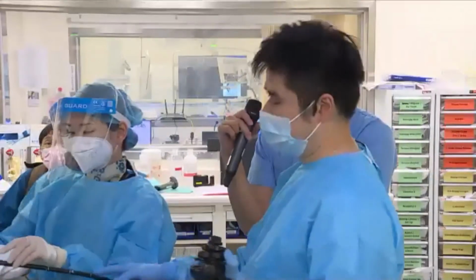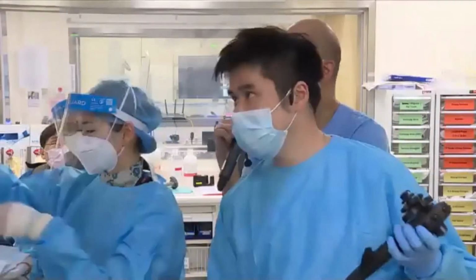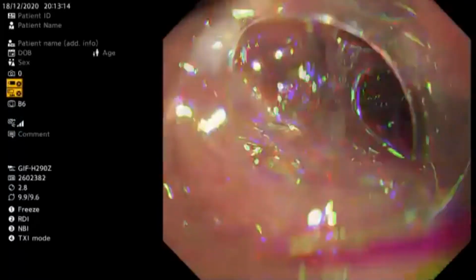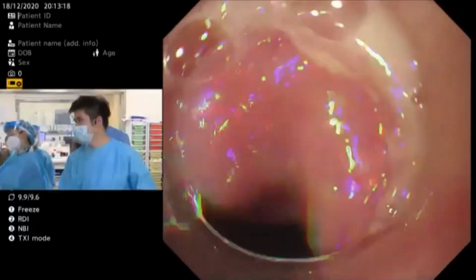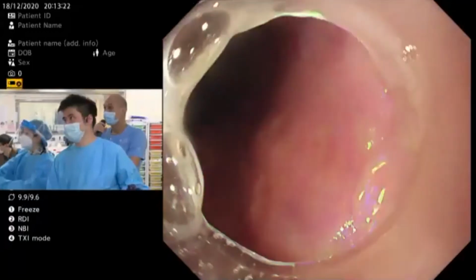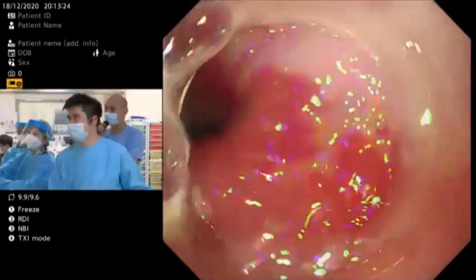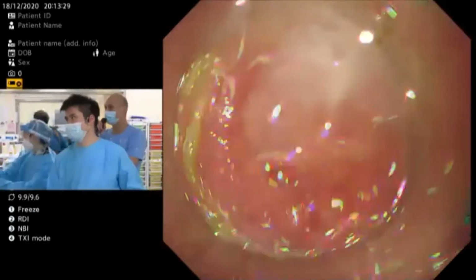What about the full thickness hood that you're using? Can you say that again? Is it a tapered hood that you're using now? What cap are you using? This is just an Olympus straight cap, transparent. Just a straight, short, hard cap, right? Yeah. And Yogesh, what were you saying?